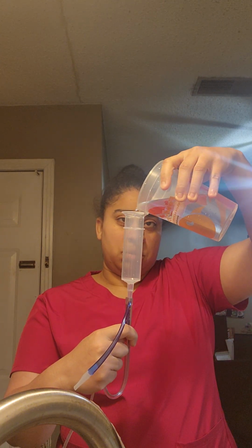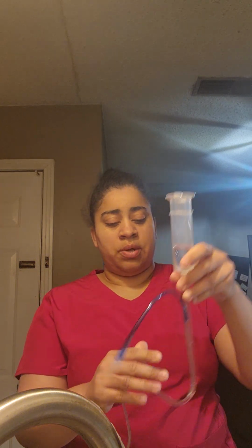When I get down to about 10, I'm going to clamp it. If I had some more medication, I would go ahead and do it, but I do not. So I'm going to clamp this because I don't want any air to get in my patient's stomach. And then I'm going to add 30 more just to make sure that I flush everything all the way down.